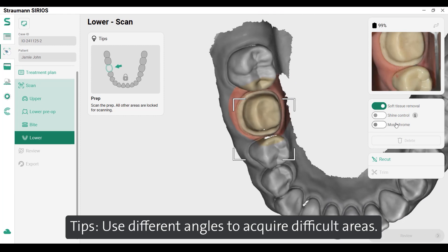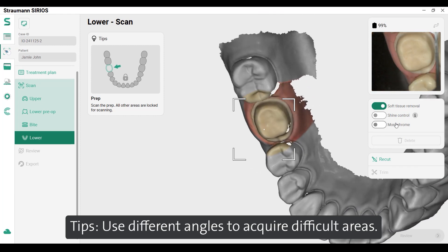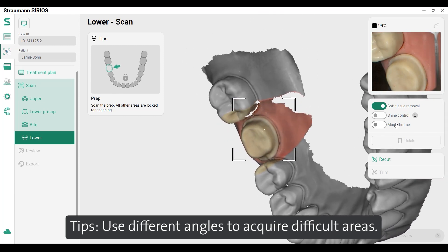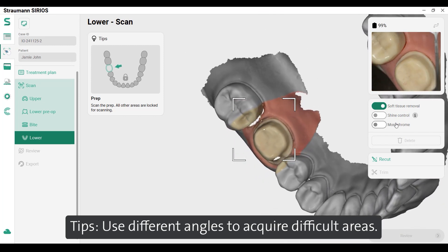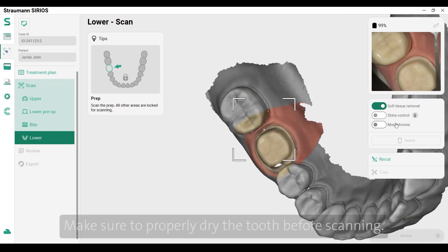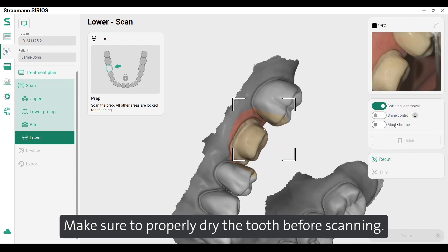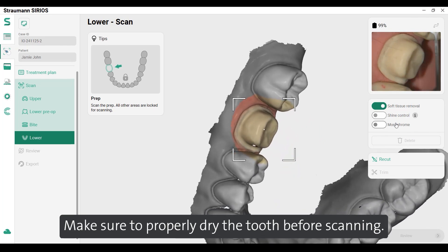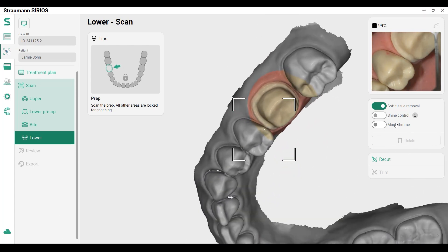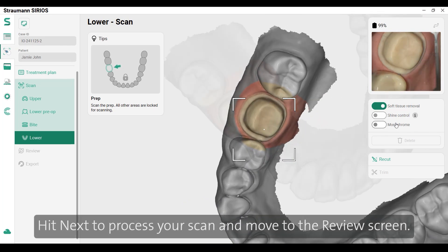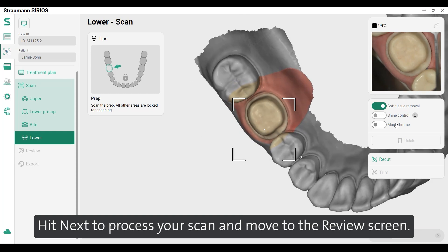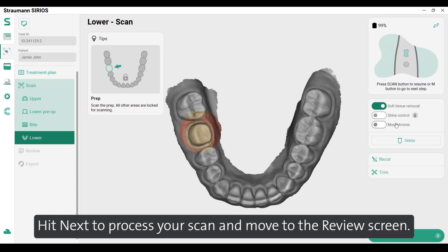Tips: Use different angles to acquire difficult areas. Make sure to properly dry the tooth before scanning. Hit next to process your scan and move to the review screen.